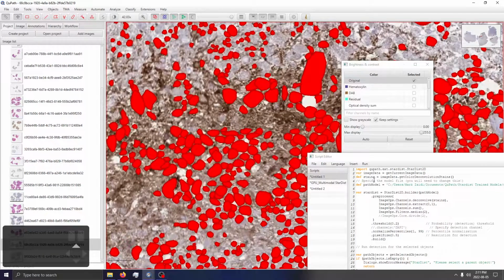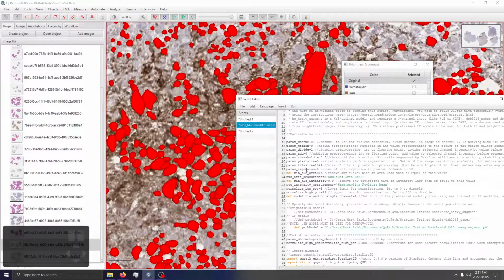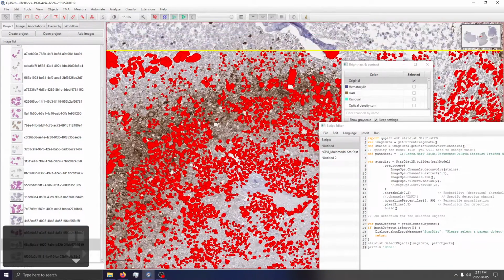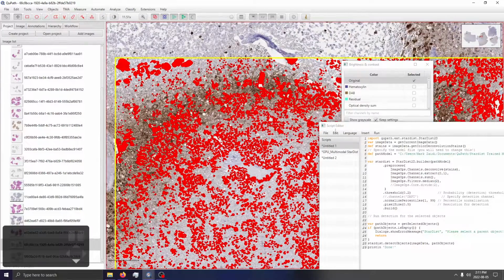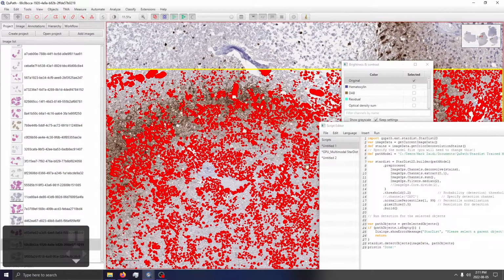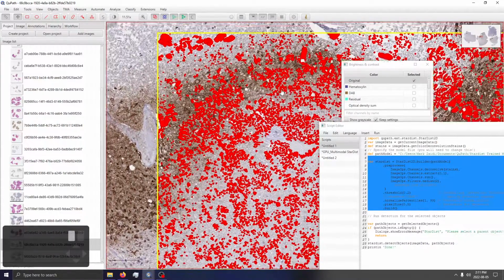You can perform filtering and deleting image objects below a certain size, as done in Universal StarDist for QuPath, but again, this is more a discussion for super users of QuPath. Because if you're at the stage where you're trying to modify a StarDist builder to support DAB-stained cell detection, that's not what I really call basic QuPath usage.